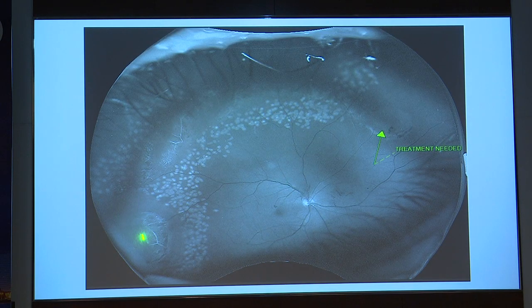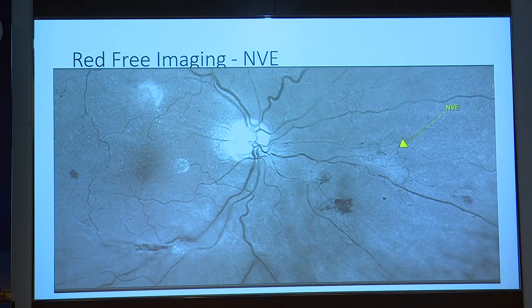Now this patient had multiple breaks, and I had to do a laser, but she was very uncooperative, blinking, moving. So I just finished the laser, and I said I'll do an image so that I can see that everything has gone well. And you can make out here that this was missed because the patient was not cooperative. So I said, okay, you can come after a day or two and I'll do the rest of the treatment. So documentation and checking that what you have treated has gone well can also be done with this.